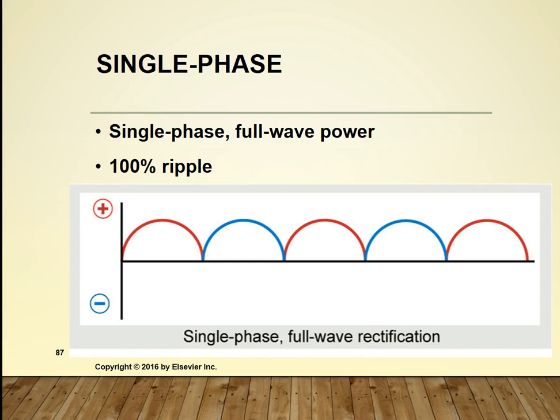I'm throwing in something else for you to try and understand, and that's with the generators that are used in X-ray machines. The energy fluctuates from 0 on the line to the maximum voltage peak of the wave, and that's called ripple. If you have single phase full wave power, you still get 100% ripple.